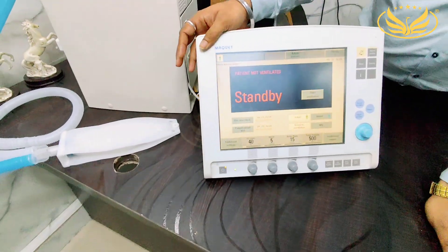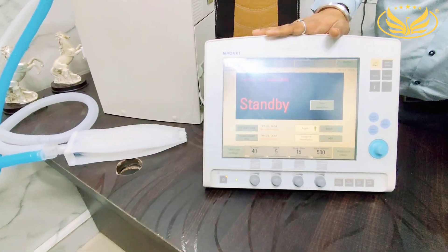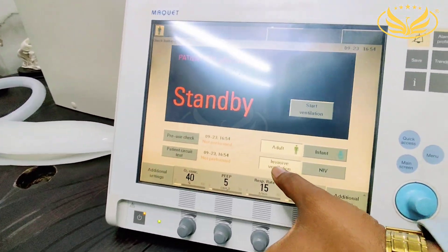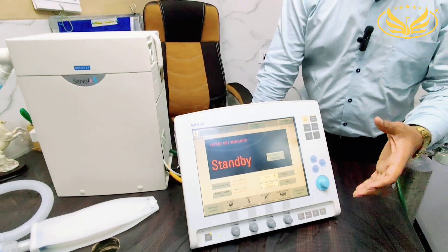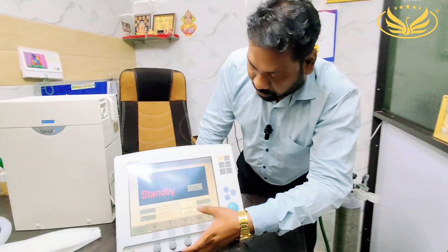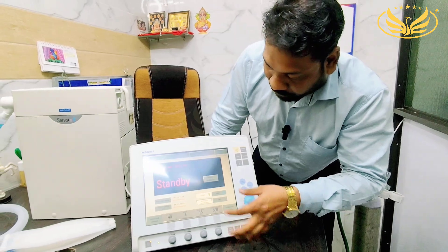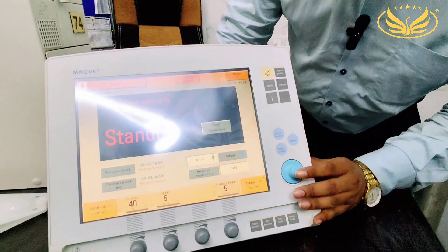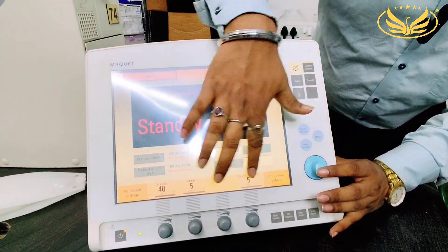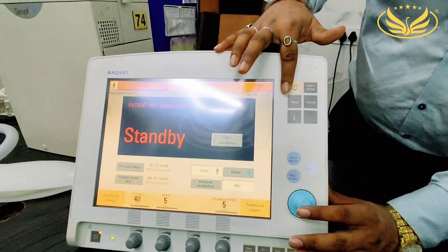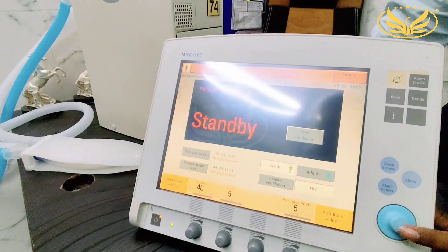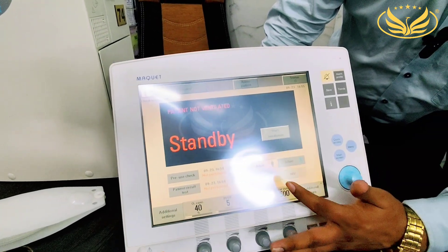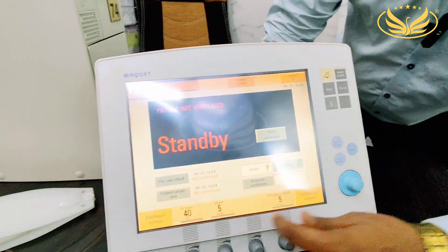In this ventilator, two types of ventilation can be done: one is invasive and one is non-invasive. If we choose invasive ventilation, that means we are giving support to the patient with the help of an endotracheal tube. The moment you click NIV, the screen turns yellow — that means it is NIV mode, meaning you can give ventilation to the patient with the help of a mask. You can choose invasive or non-invasive and the screen color changes accordingly.